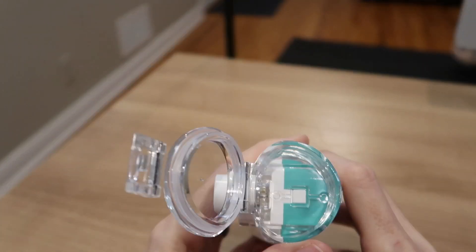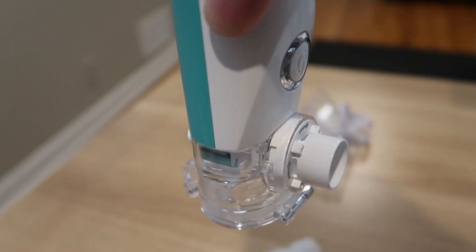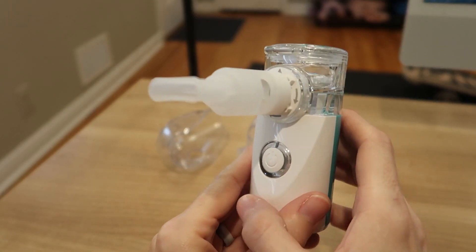To use, simply open the lid, pour in the medicine or hypertonic saline solution. It has a really great seal — nothing's gonna leak out of there. Then install the mask or nozzle and short press the start button.